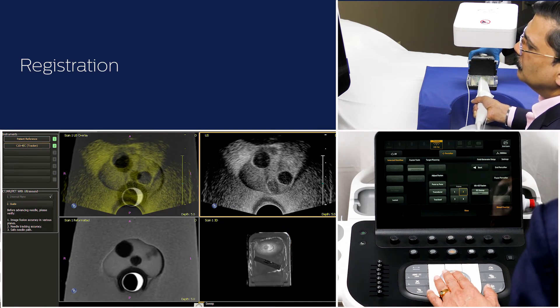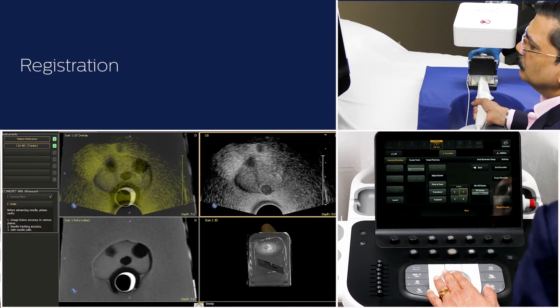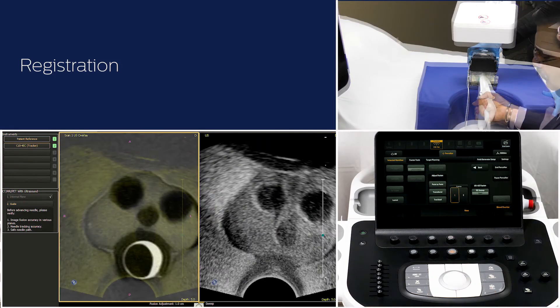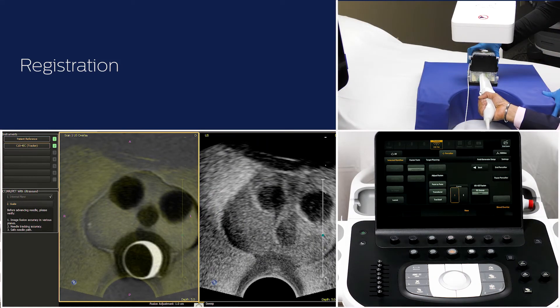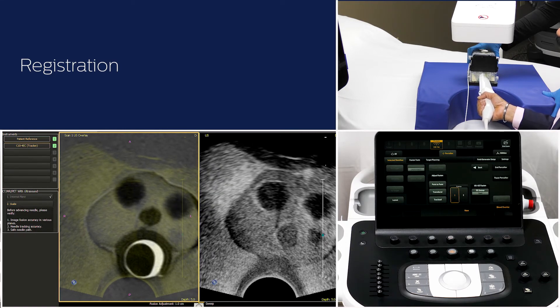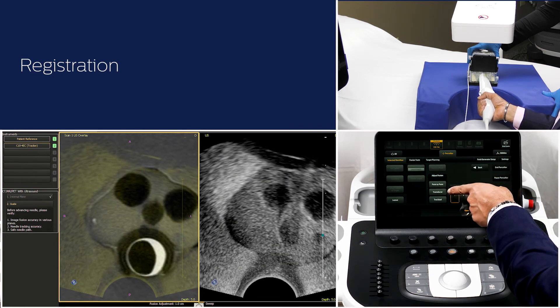Keep in mind that too much transducer pressure can change the position and shape of the prostate. In case you want to make fine adjustments to the fusion, you can use the following controls: point-to-point, transducer, or drag ball.